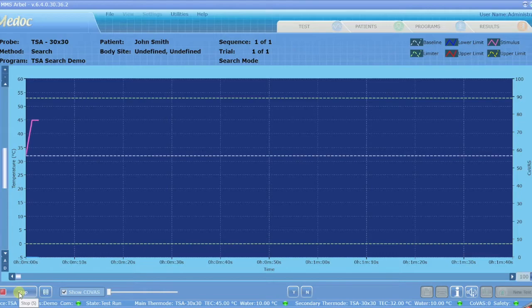Okay, it runs with 30 degrees per second up to 45 degrees. And let me just go ahead and press the yes button once, another time, and continuously. When I do it with the no button, it looks like this. No, and continuously. And then soon it will end, as I chose 30 seconds.